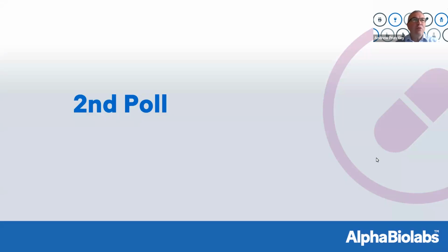Second question, if your client provided a 6 centimeter head hair sample for an overview only, how many results would you get? And 66% of you got that correct. It's actually 2 results, each covering a 3-month time period. So well done to you guys, and thank you to all of you for completing that poll. So I'm going to stop sharing now, and with that I will hand back to Ashley.